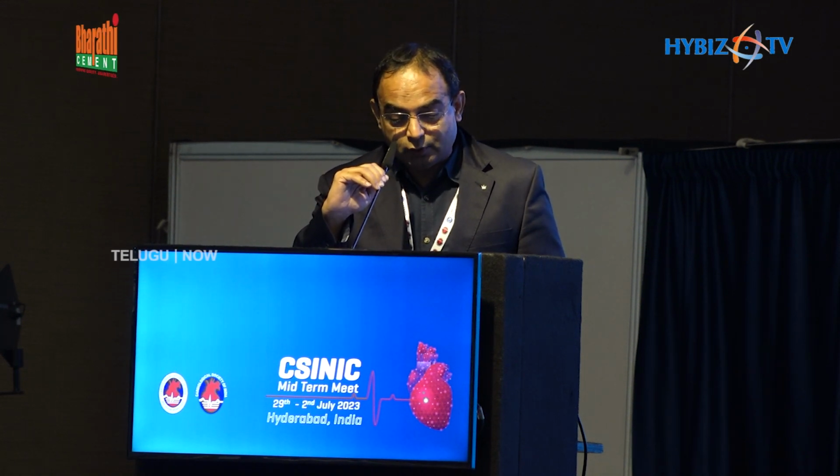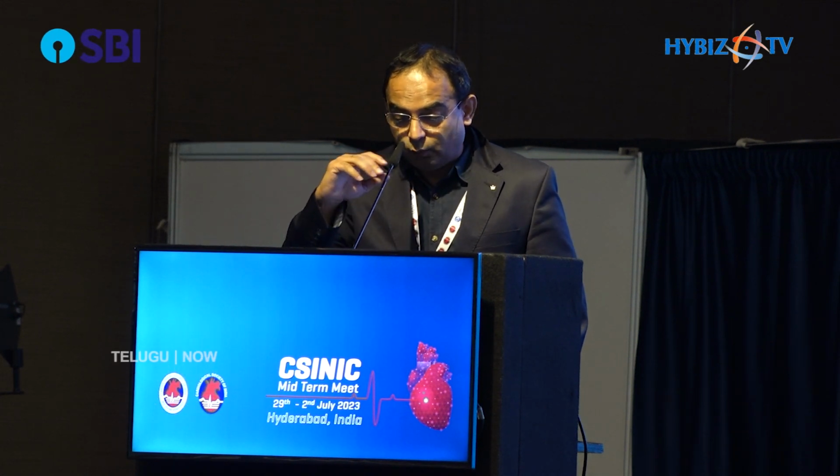So how do we react now? Shall we go ahead and convert to a dual stent strategy, or should we do something for this so-called ostial circumflex pinching? The patient was hemodynamically stable by then, fully conscious, and there was no hemodynamic compromise with this ostial LCX pinching. So we decided we'll initially assess this LCX, but before that we post-dilated the distal LAD stent with a 3 mm NC, and the proximal LAD stent with a 3.5 NC, and we did a POT.